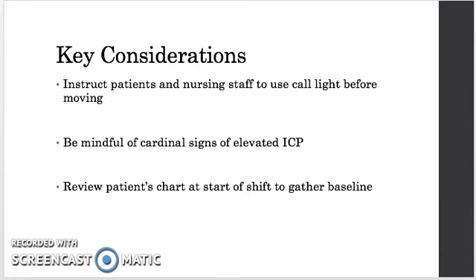So wrapping up this presentation, there are some key considerations I'd like you to take away. Like I said, patients with a ventriculostomy should not move without speaking to a nurse and without the assistance of a trained nurse aide or a nurse. And look for cardinal signs of elevated ICP, so confusion, headache, establishing a baseline, really knowing how that patient was last night, and what he looked like at the beginning of the shift especially.